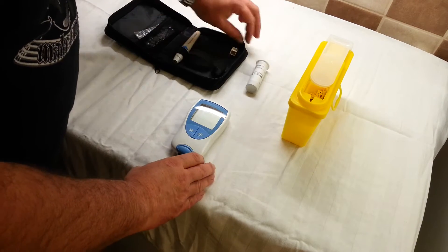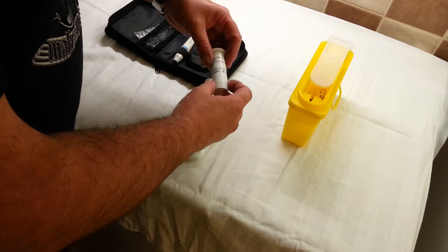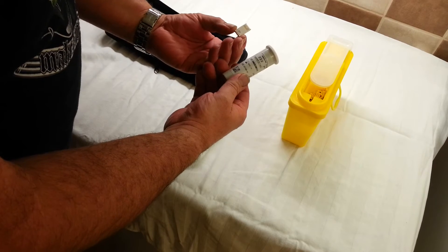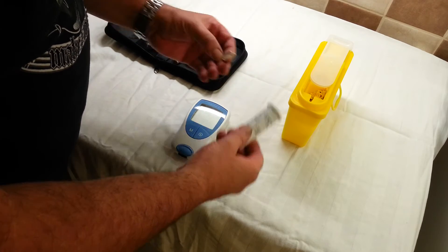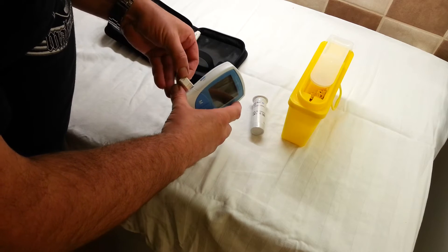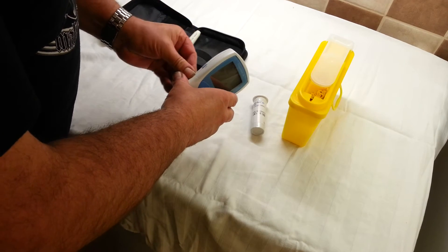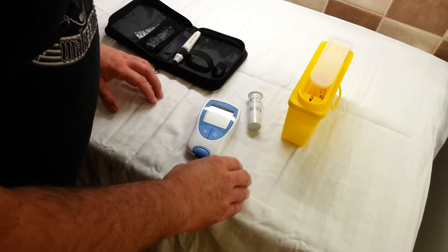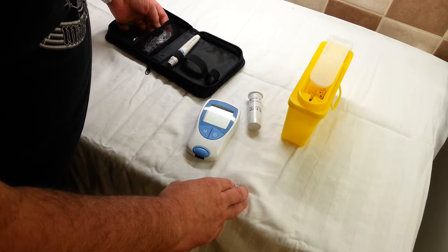The way the strips work, and to ensure accuracy, is that each batch of strips is given a batch number and a chip is put in the packet with it. That chip is inserted into the side of the tester, and the quality control information for this batch of strips is then loaded into the machine.